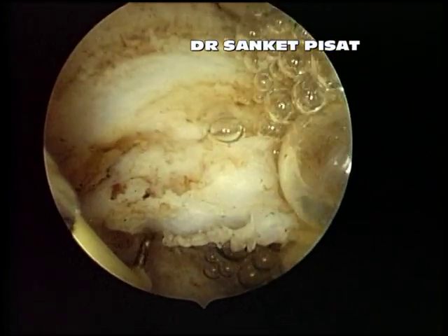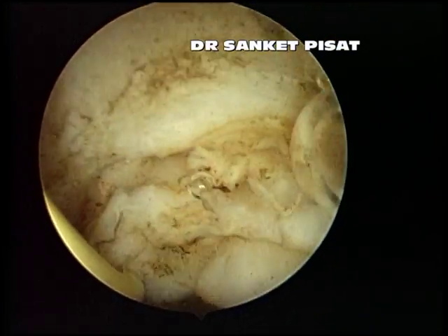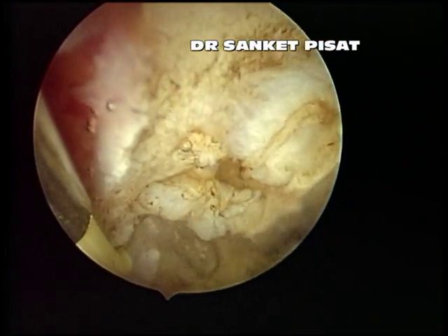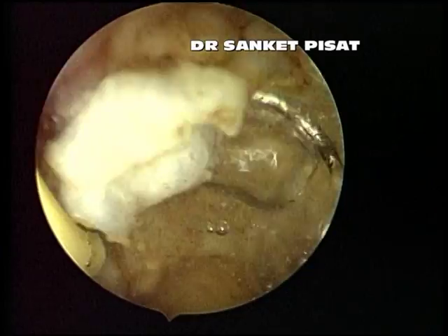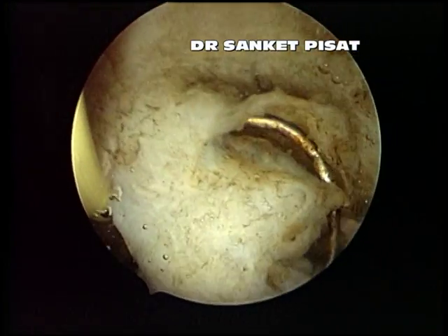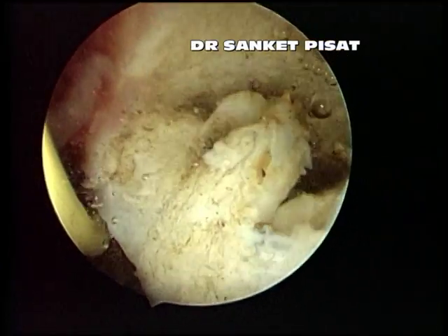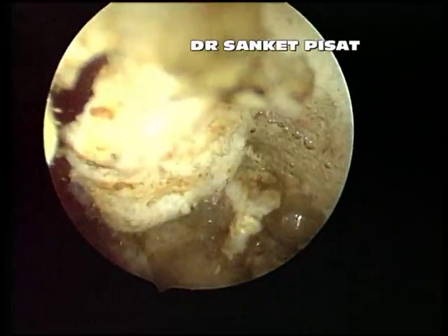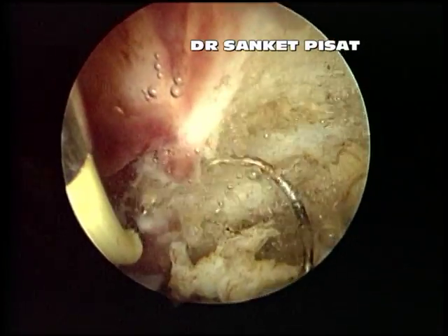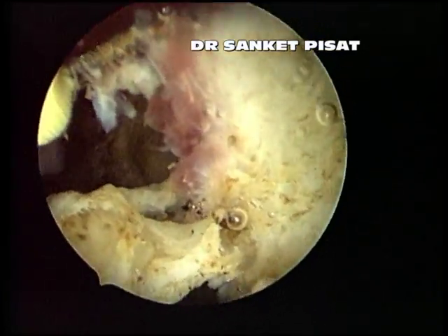It is very important to not forget the basic principles of resection and to activate the electrode only while resecting away from the fundus, except when very short bursts of energy are used in order to detach the fibroid from its attachment to the capsule and from its attachment to the normal myometrium. As we can see here, the remnant pieces of the fibroid are slowly getting detached from their attachment to the uterine myometrium.